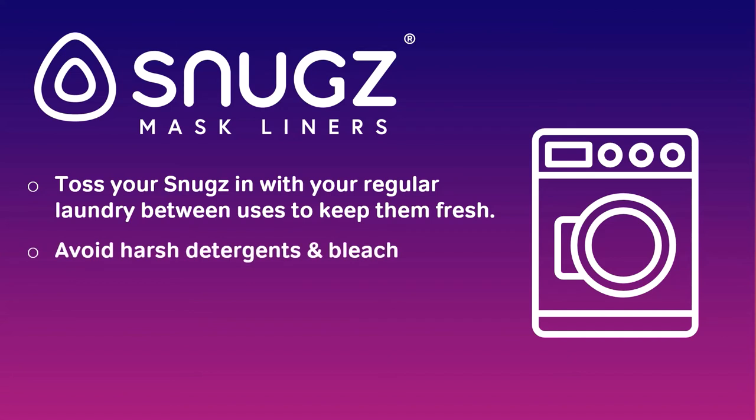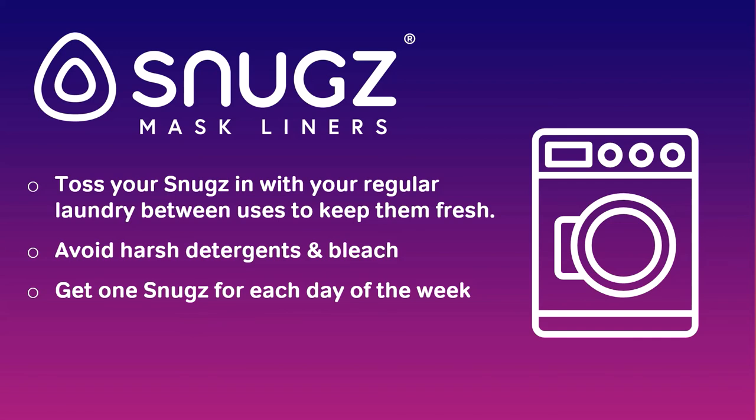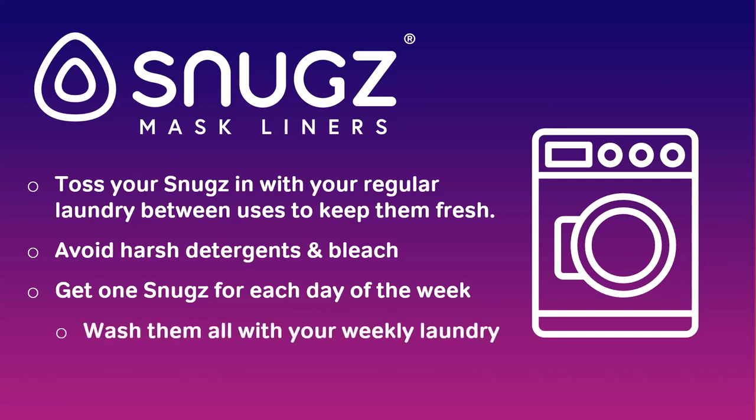To make life with CPAP easier, we recommend having one Snugs for each day of the week. That way, you simply wash them all in your normal weekly laundry and then have a fresh one for each day.